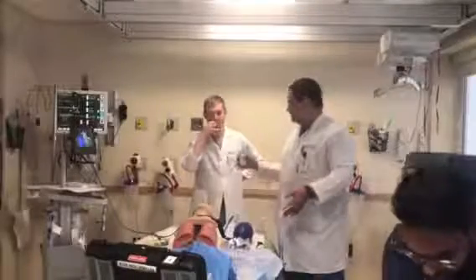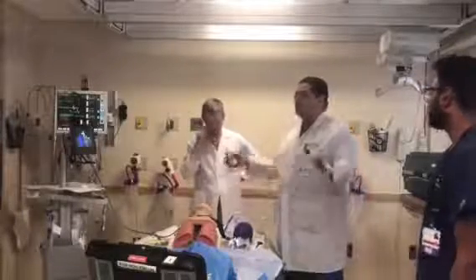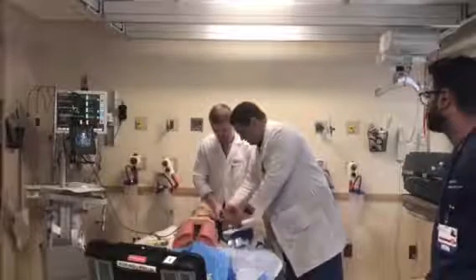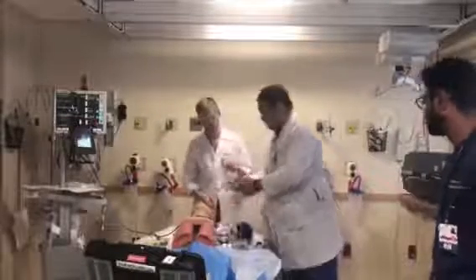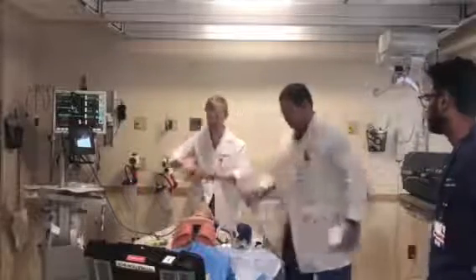Oh, you actually want it? Let's not use the regular LMA because it's a step that needs to be removed and then intubated again. The intubating LMA saves a step. So let's put the regular LMA first, although that's not going to be part of our algorithm. Our algorithm, I'll show you the other one, is the intubating LMA, right? So how are we going to do it? Show me the technique.